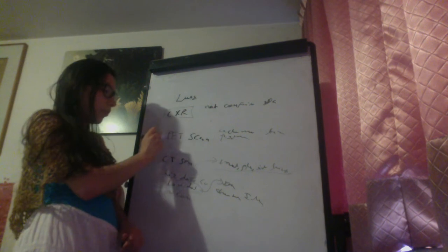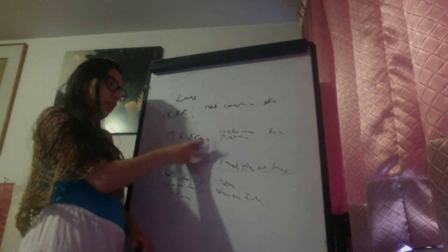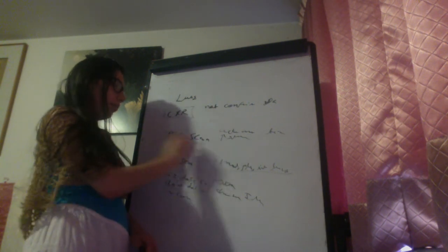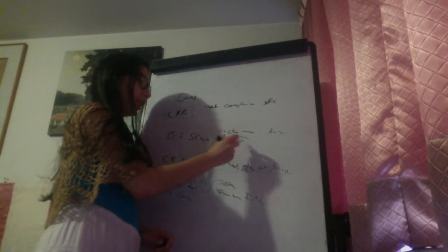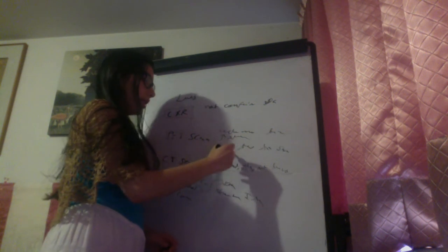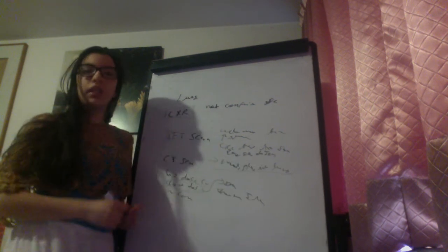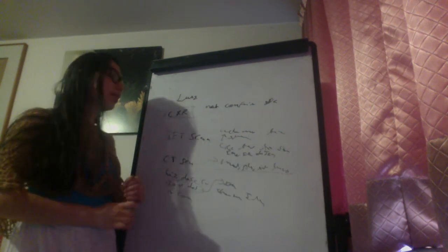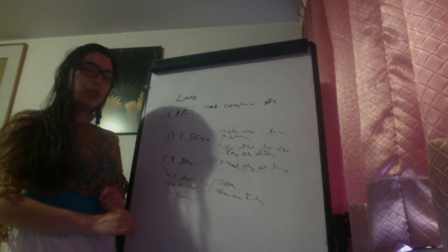Usually it is also performed with a CT in order to localize anatomically the metabolically active lesion that we are seeing in the PET scan. And this is an excellent test to see early stage of diseases, and this sometimes will be needed for lung cancer. We will see this in the solitary nodule video.